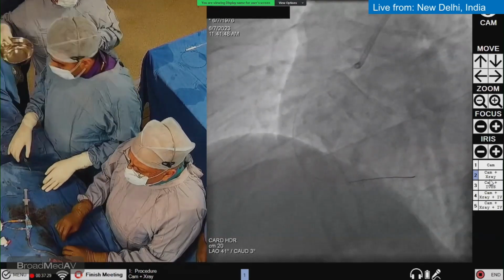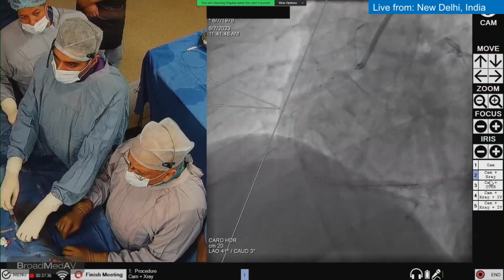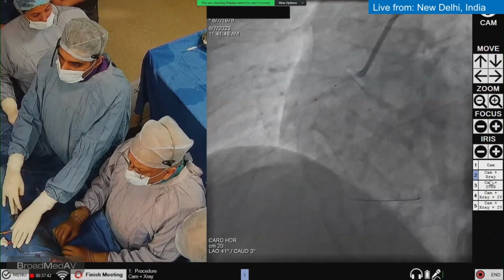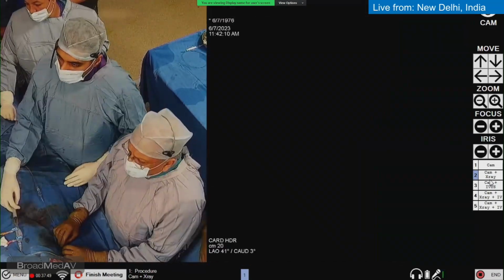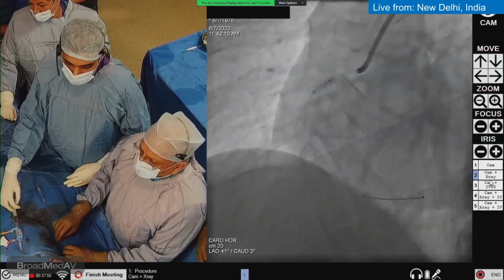ACT. So this young patient, I think we are very happy doing a drug-eluting balloon here, because for his artery, it will be very nice to have no stent inside. Check, please. Go up. 1, 2, 3, 4, 5, 6, 7, 8, 9, 10, 12, 14. Deflate.